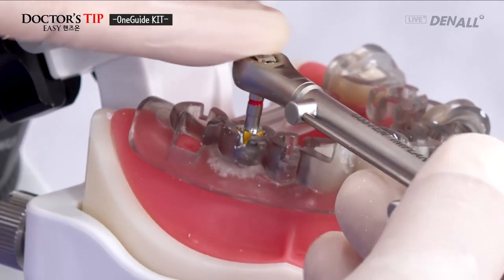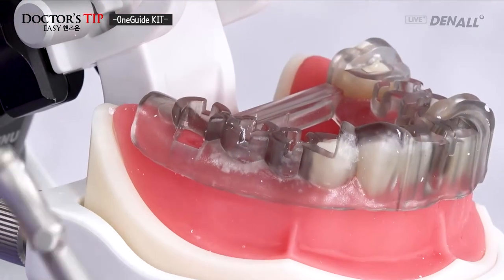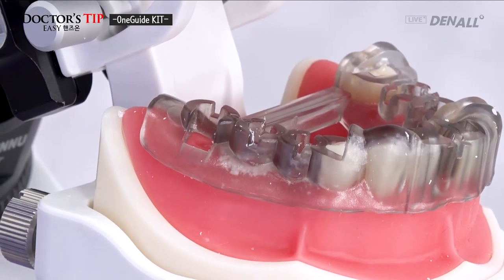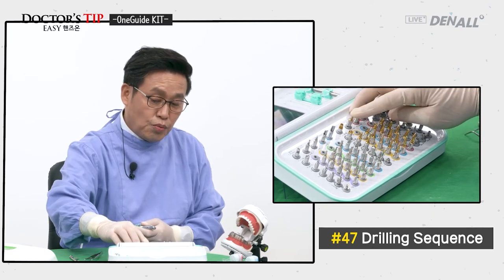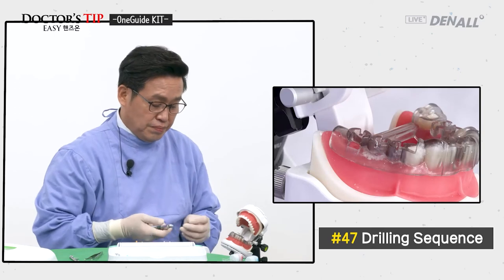Now it's in the position that we have planned. The depth control and hex positioning is accurately done. Two implants have been placed. For 47, I'm going to begin with a 3.25 millimeter initial drill, and the wide barrel is going to be used.